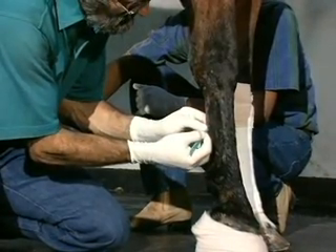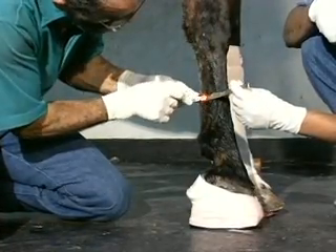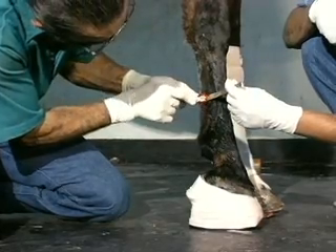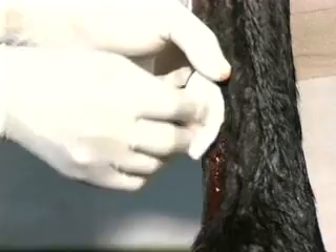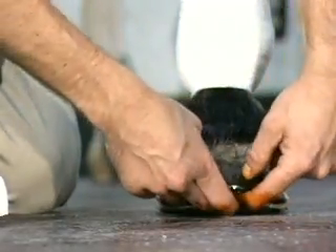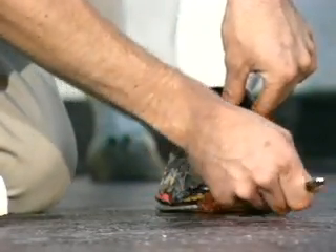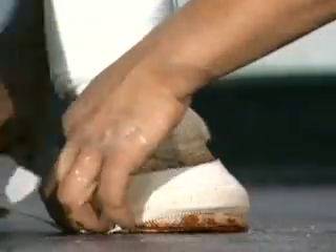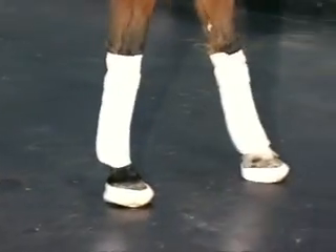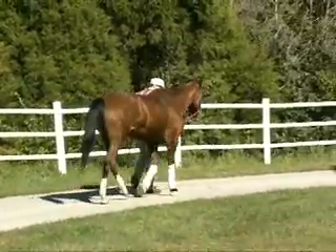I will do both legs at the same time — there's no reason to do one and wait a week or so before doing the other. I can't stress how low risk this procedure has been for me. We've actually performed hundreds of deep flexor tenotomies following the derotation process with very good results. The toes are packed off with betadine. If the horse is very sensitive, sometimes I'll put a little DMSO in the betadine for a few days. You can medicate all penetrations through the front of the shoe using the shoe as a hospital plate. Note this mare's stance immediately after surgery — the ankles have not dropped, the toes are not hyperextended. Notice her walking here — she's still blocked, but note the hind limbs; she's moving very freely.